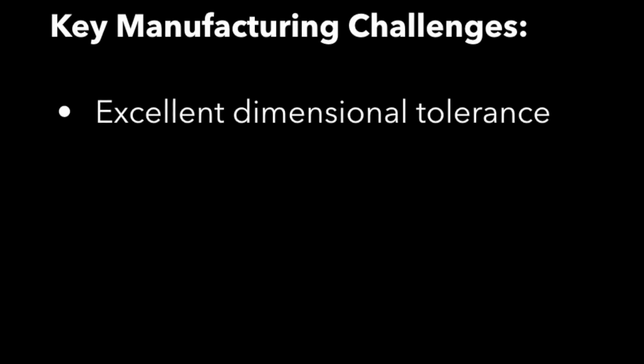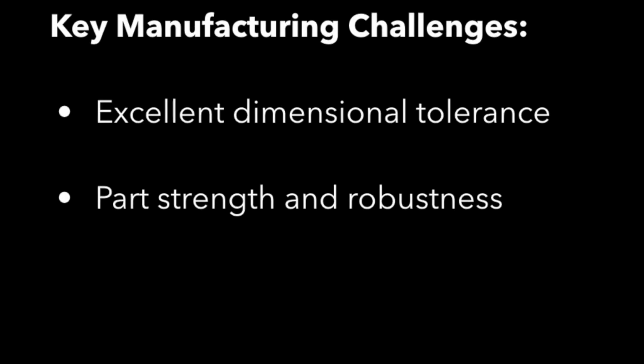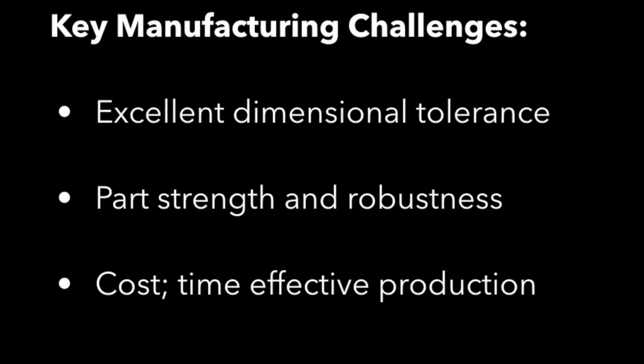Some key challenges when manufacturing orthopedic implants such as the one we will make today are achieving excellent dimensional tolerance so that the implant will sit properly on the bone, part strength and robustness for spinal support and longevity of the implant, and keeping time and material costs low so that patients have access to these affordable implants.